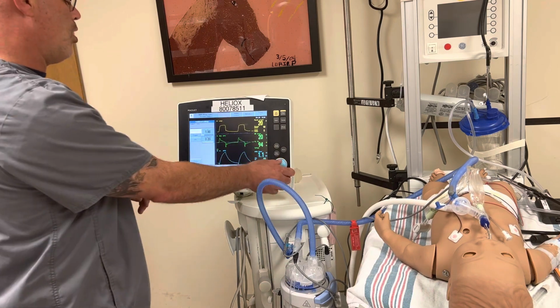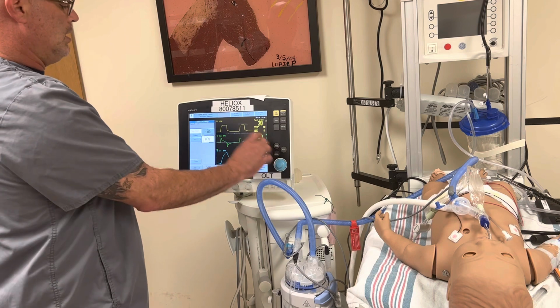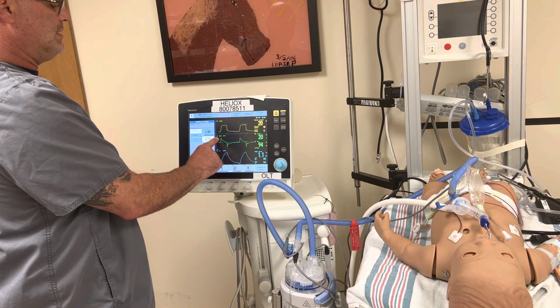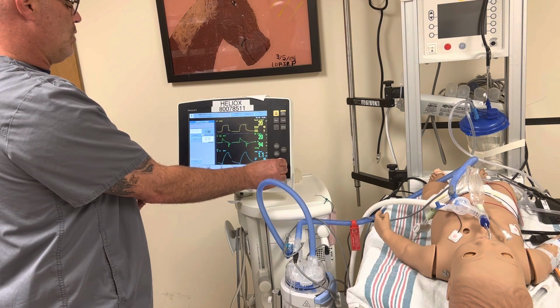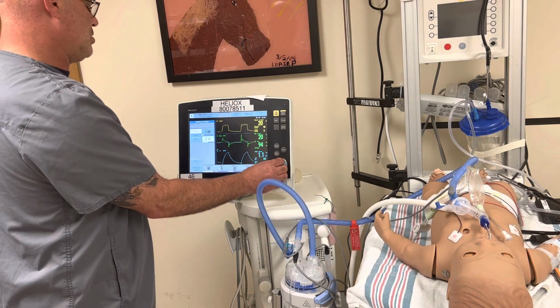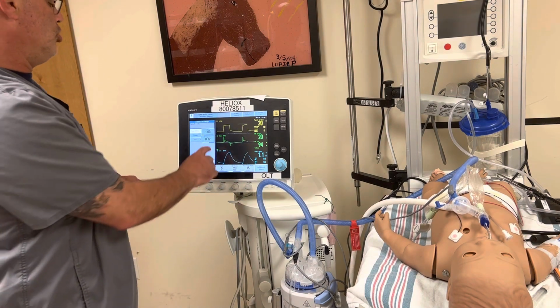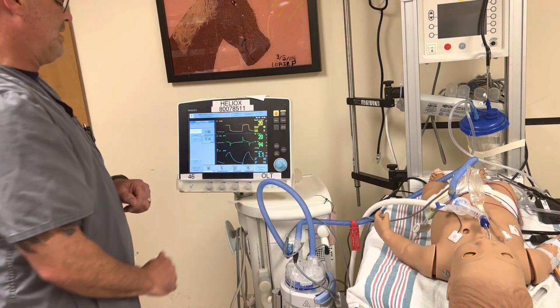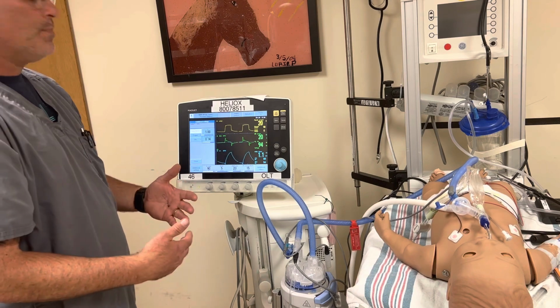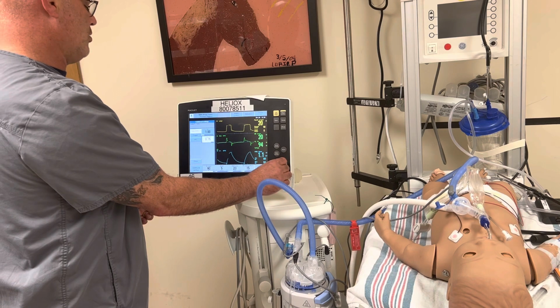So what we target always is the nice decelerating waveform, not too slow. Too slow is rounded at the peak. See how it's rounded off? So I don't want it rounded. I want a nice, is close to, that's too fast, so I'm going to slow it back down and get to a nice area where it's as close to a decelerating waveform as I can get, and we're going to do that on every single patient, of course, unless it's ordered otherwise.